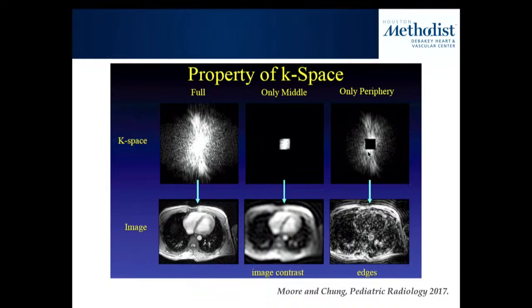And this is partly what you use for MR angiography, for example, where you say, hey, I want to see the artery, but I don't want to see the vein. So how can I get rid of the venous signal altogether? Well, if I sample my acquisition such that the center of K-space is acquired when the contrast is in the artery, but there's no contrast in the vein, then I don't see the vein at all, right? So that's a way to basically suppress all the other background signal except for what's in your artery itself.